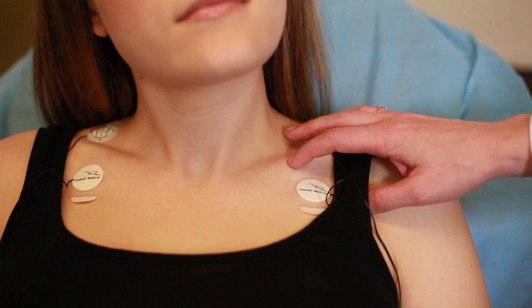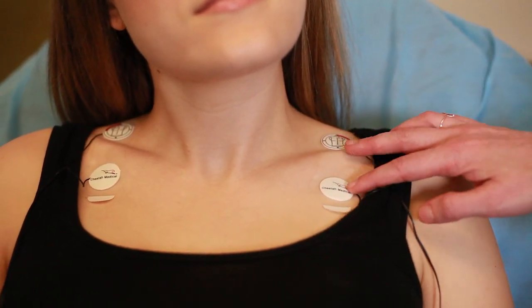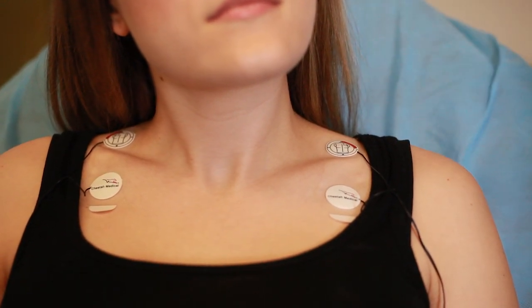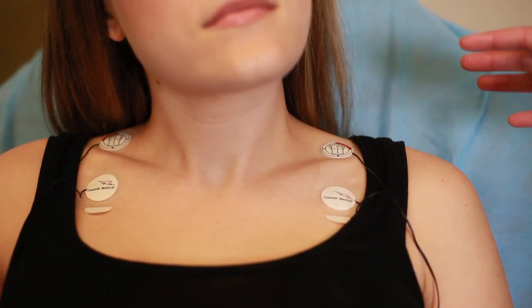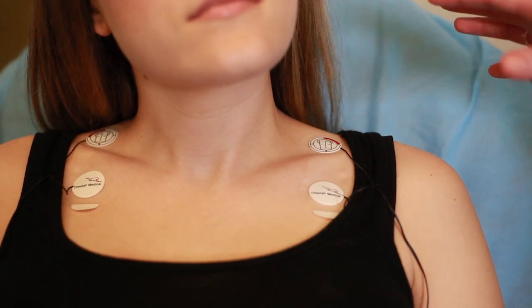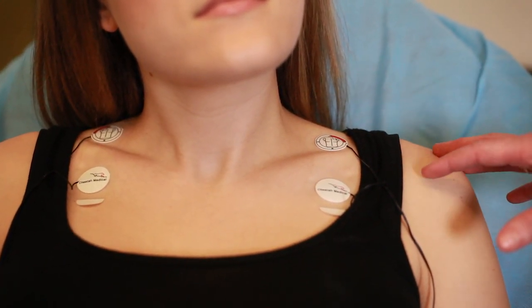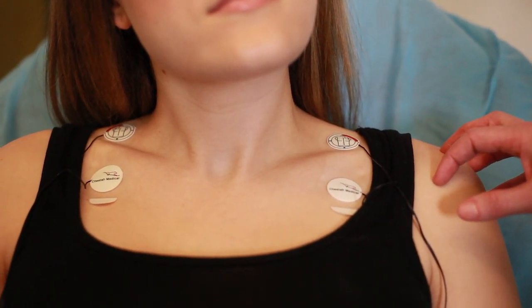So we're going to actually stop right here while Annie finishes her baseline, and we're going to recap what we've done so far. We put 4 sensors on Annie's torso, okay? We turned the monitor on, we entered her MRN, her age, weight, height, and gender, and we pressed start. We let the monitor auto-calibrate, which we now know is different than getting a baseline, and then we initiated performing a dynamic assessment, which we are doing now.